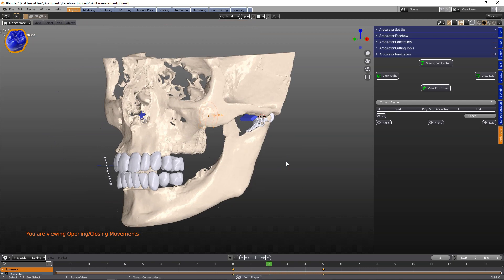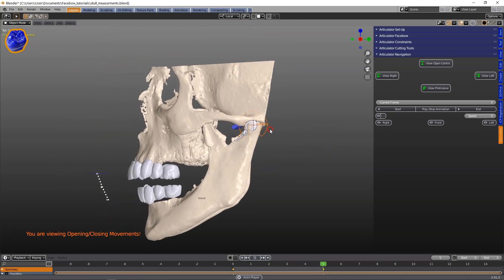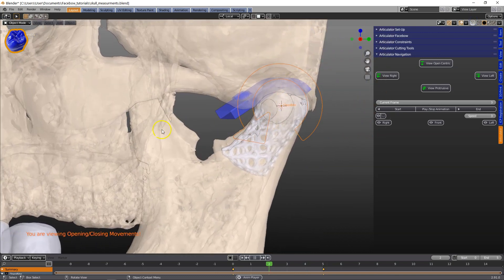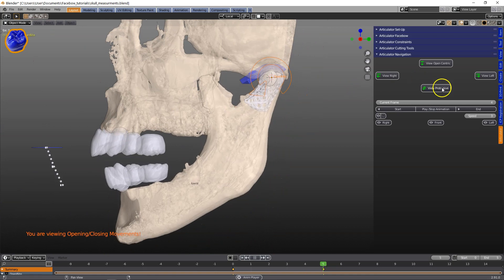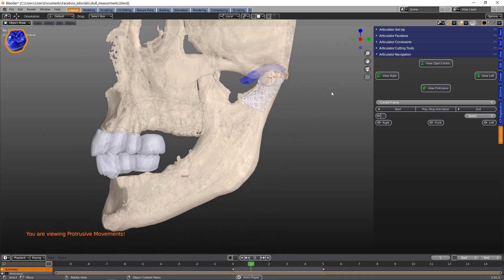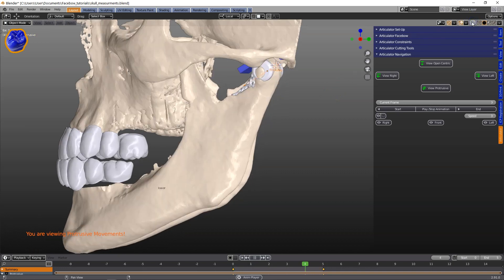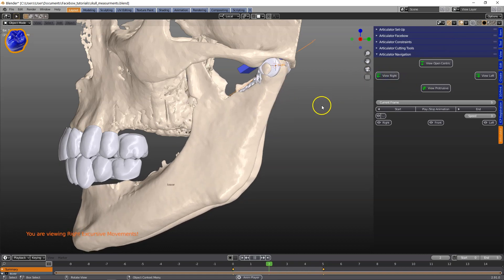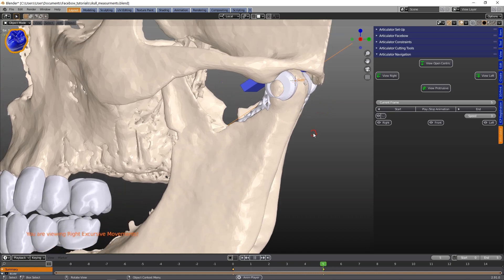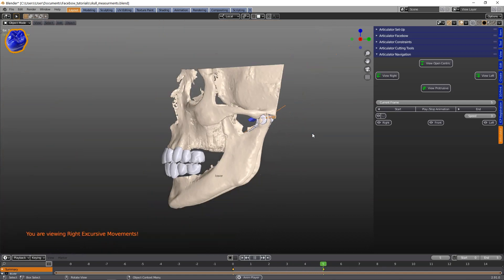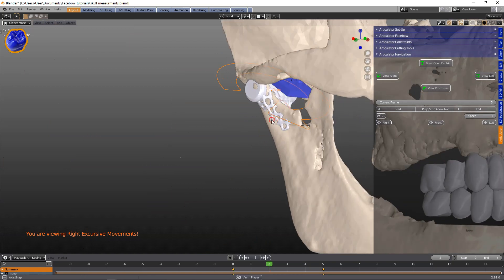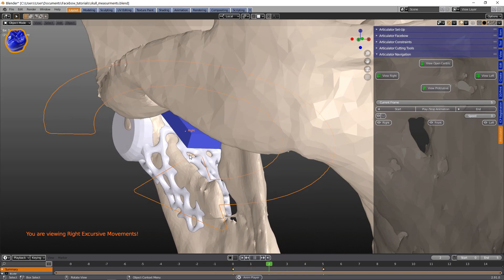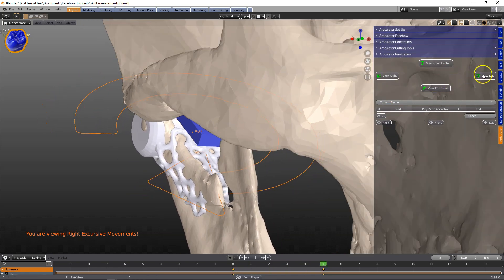From the patient's right-hand side, the point of rotation is exactly where the TMJ and eminence are, and then moving it forward it slides down exactly along that angle. For the excursive movements, it moves down on one side and shifts gently across with the Bennett 1-millimeter side shift as the jaw moves into excursive movement.